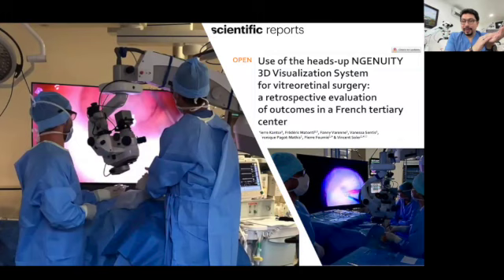But what's the problem? The price is one problem. Maybe a microscope for neurosurgery or for ophthalmology will cost $500,000. And $500,000 is not an investment that a dentist wants to make for having magnification. And you can see that those microscopes are huge. Maybe you will need a very big operative room for having one of those. And the screen is not integrated to the microscope, which generates a problem. You can see the surgeons here working in an eye, and the microscope is in front of them, in between them and the screen, and it is generating distractions in the area.